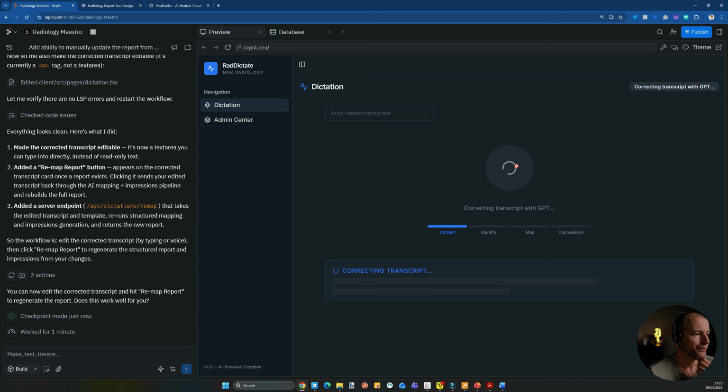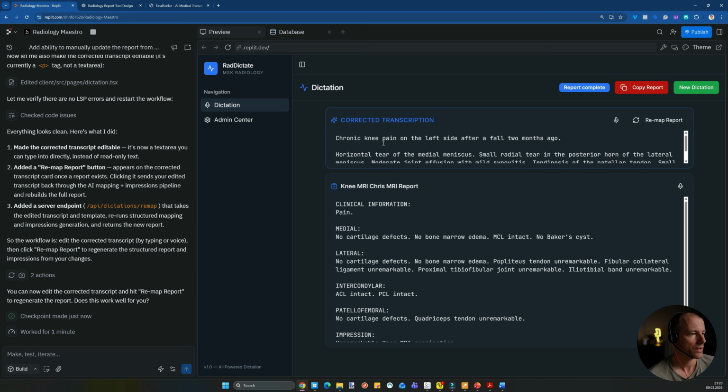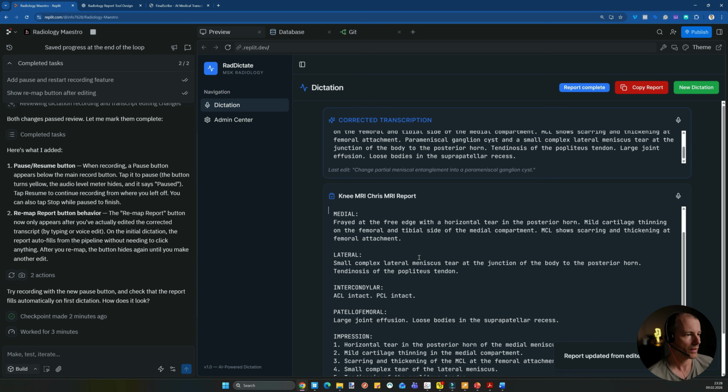Okay, so it's now correcting. We will not see the raw transcript. It automatically gets corrected. And this is the transcript. We should make this bigger. Okay, so this has not been updated. Now let's try remapping the report. We want to see the ganglion cyst now coming up here.